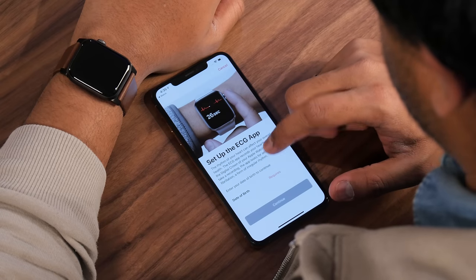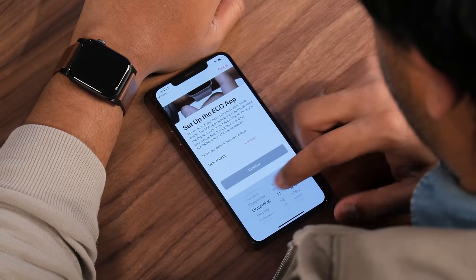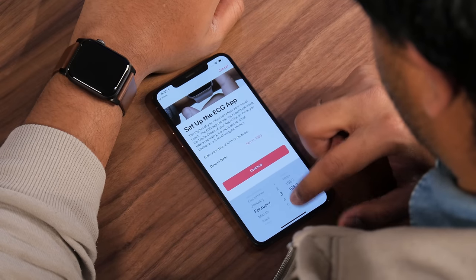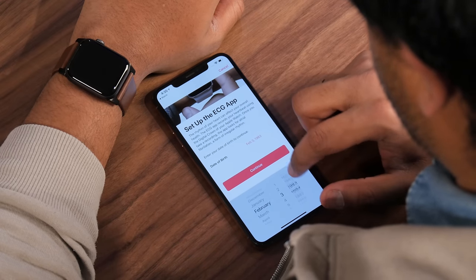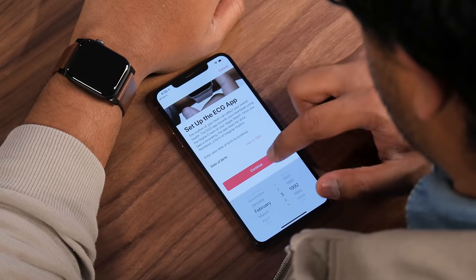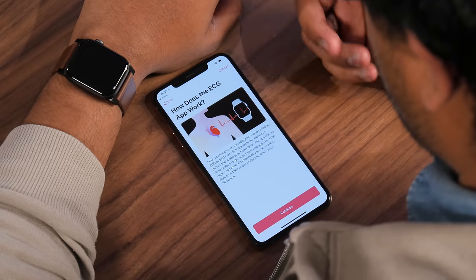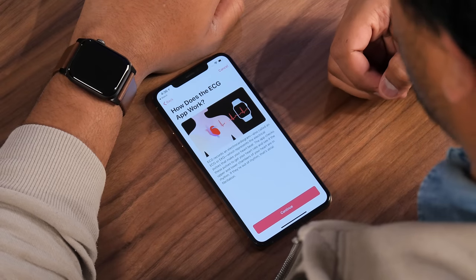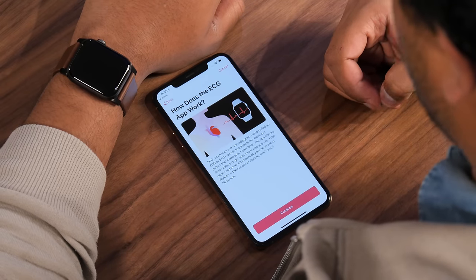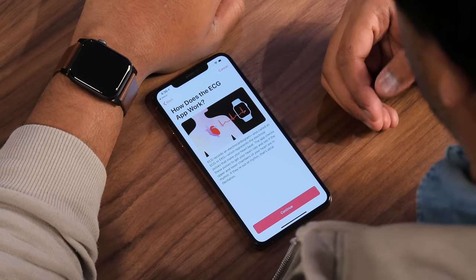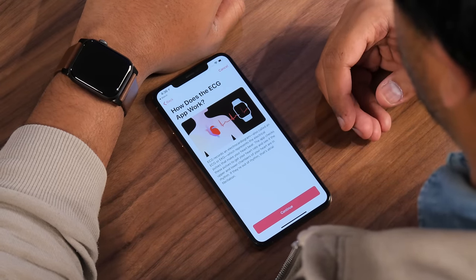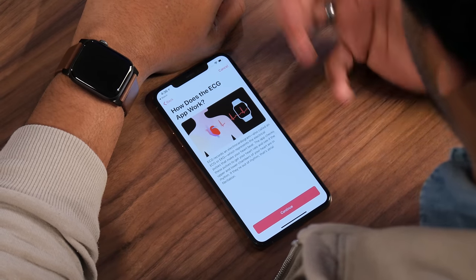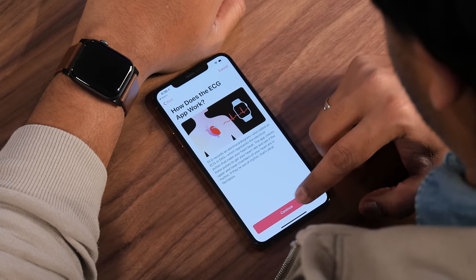The first thing you need to do is set up the ECG app. You'll need to add your date of birth. There's a brief rundown on how it works: the ECG records an electrocardiogram, which represents the electrical pulses that make your heart beat. The app checks these pulses to get your heart rate and see if the upper and lower chambers of your heart are in rhythm. If they're out of rhythm, that's atrial fibrillation.